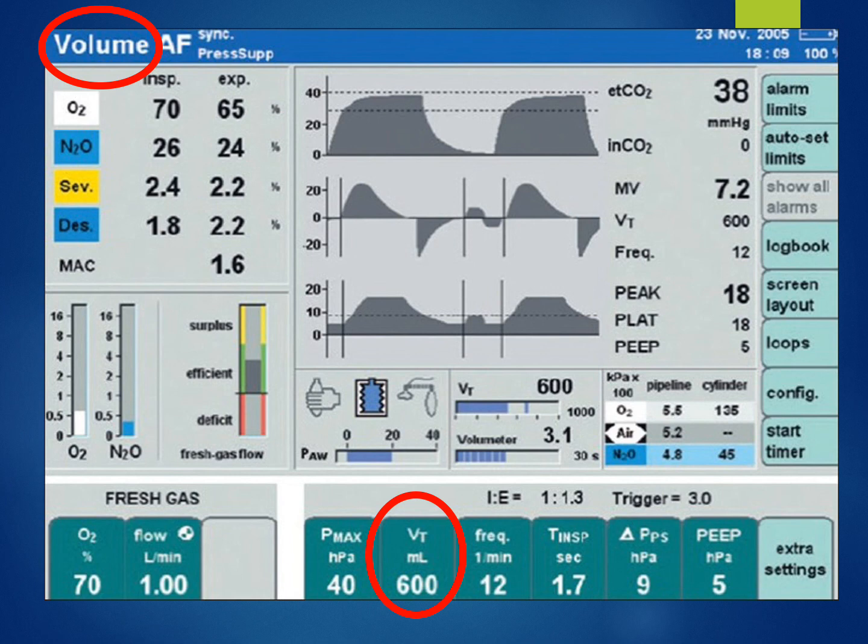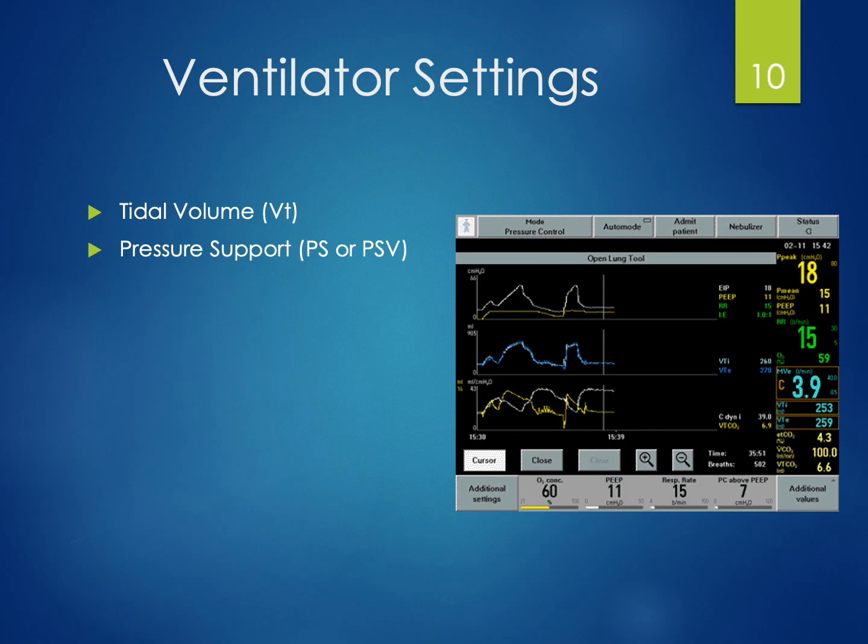So any modern ventilator should have the capacity to be programmed into either a pressure mode or a volume mode. Now there's a lot more to a ventilator than just pressure or volume. For instance, how many breaths do we give the patient? And we say we're pushing air into them, but how much oxygen will be in that air?